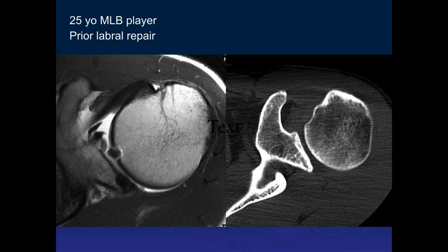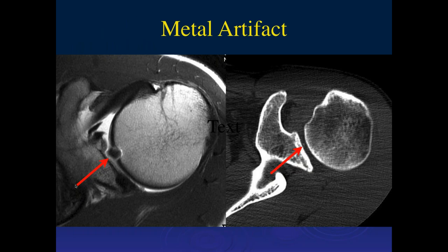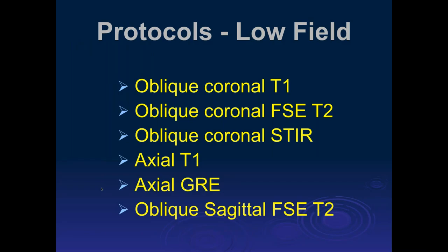Here's a 25-year-old Major League Baseball player with a prior labral repair. We can see a small density on CT in the region of the articular cartilage, and when you have metal, you get a much bigger blooming artifact on MR. When we know there's metal, we like to do metal suppression techniques, though they're still far from ideal on MR. Sometimes CT can be helpful, and some metals are less worrisome than others on MR.